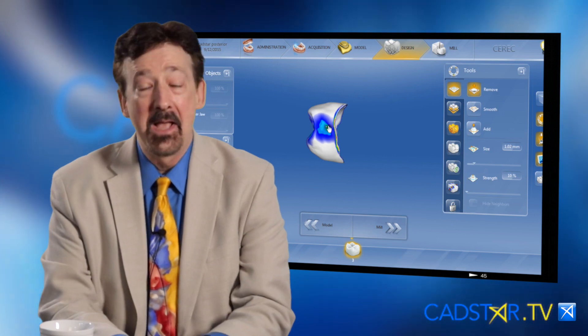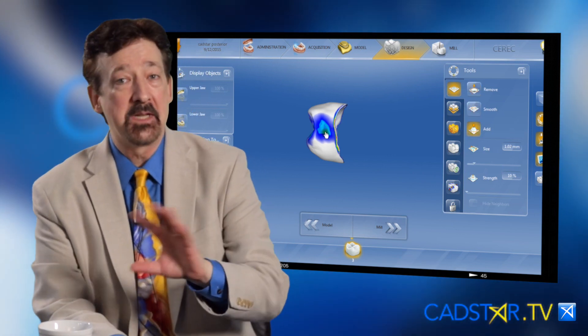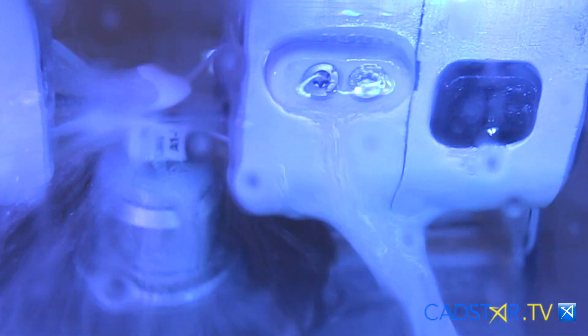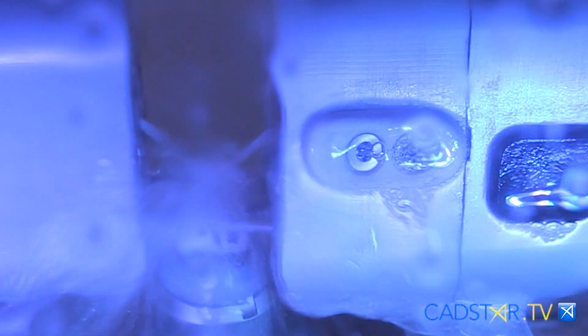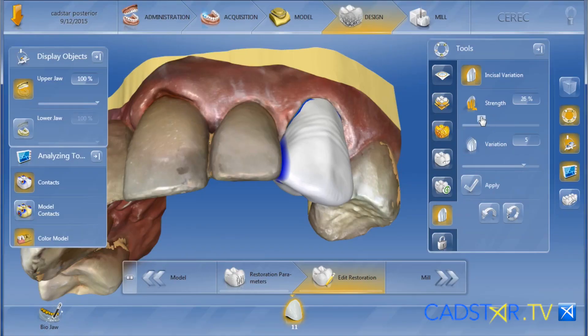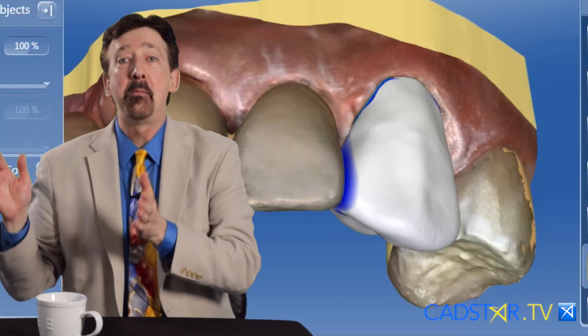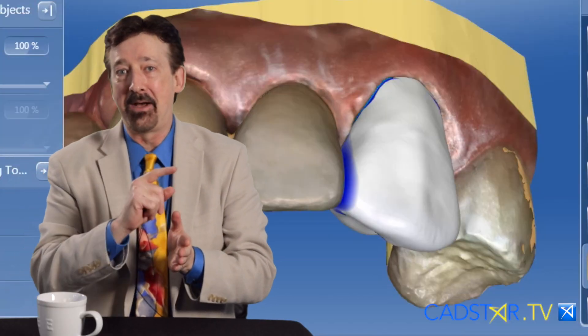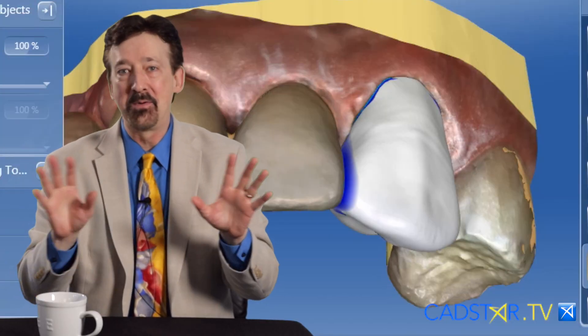I don't want to fiddle. What I've noticed in my classes as I teach, a lot of users have a tendency to smooth their restorations too much. When you smooth your restoration, it's not going to make a difference once it comes out of the milling unit, but you have a tendency to lose some of those subtle micromorphological effects of the restoration that automatically happen in the software. You don't want to remove that.